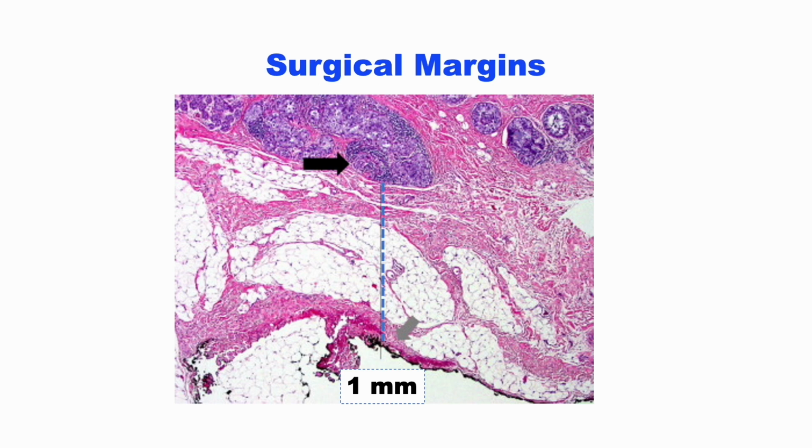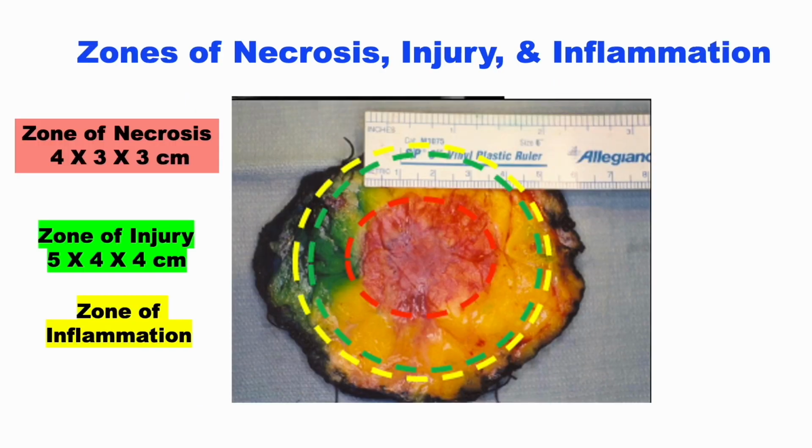In contrast with surgery, where a 1 millimeter microscopic margin is considered acceptable, the inability to perform microscopic margin assessment with cryoablation calls for the provider to cryoablate an even wider gross margin, ideally 5 to 10 millimeters beyond the edges of the cancer, the goal of which is to minimize the risk of leaving untreated residual disease in the perimeter of the main tumor mass.